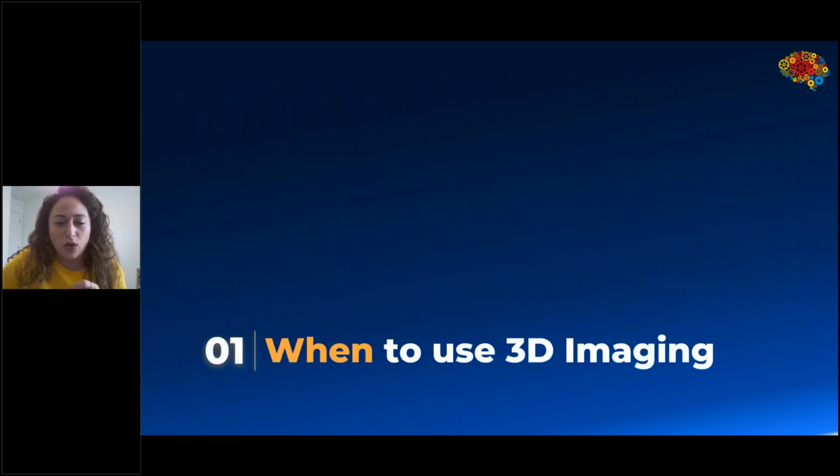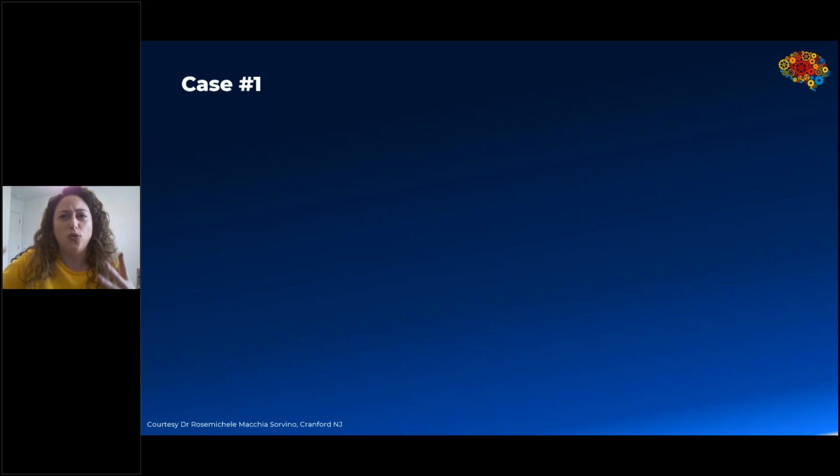Okay, so first part, when to use 3D imaging. We're going to talk about cases beyond implant planning or third molar extraction. I know you already know not just that we need cone beam for that, but you know when to take it and what to look for. So we're going to talk about cases besides that.